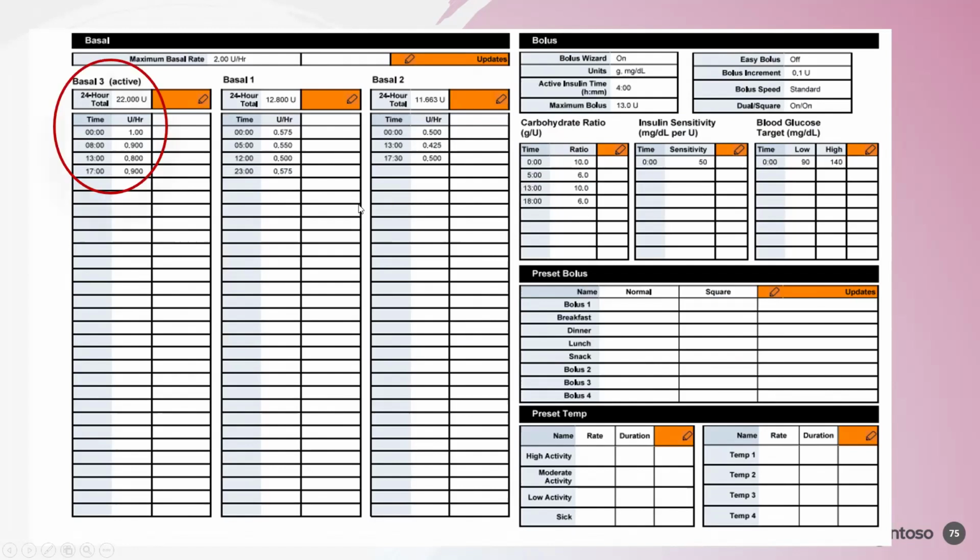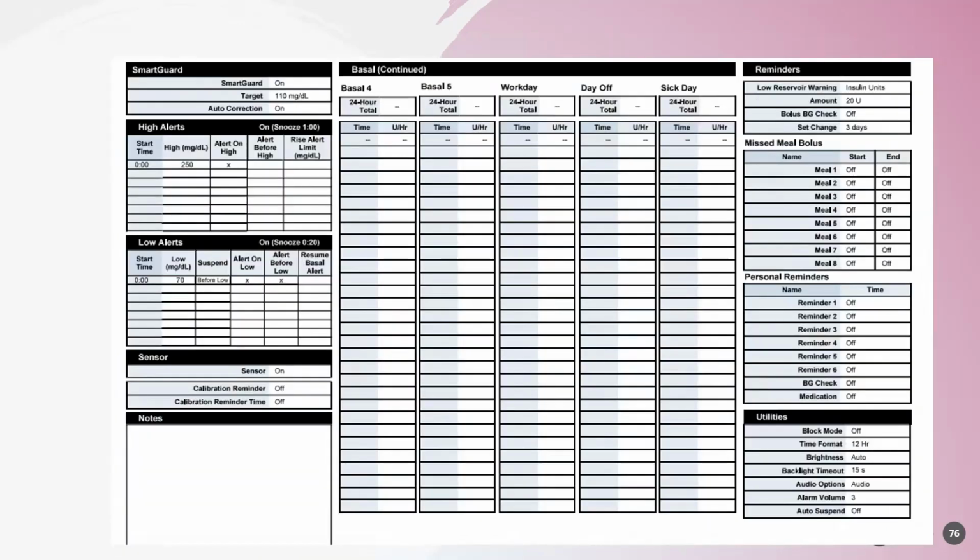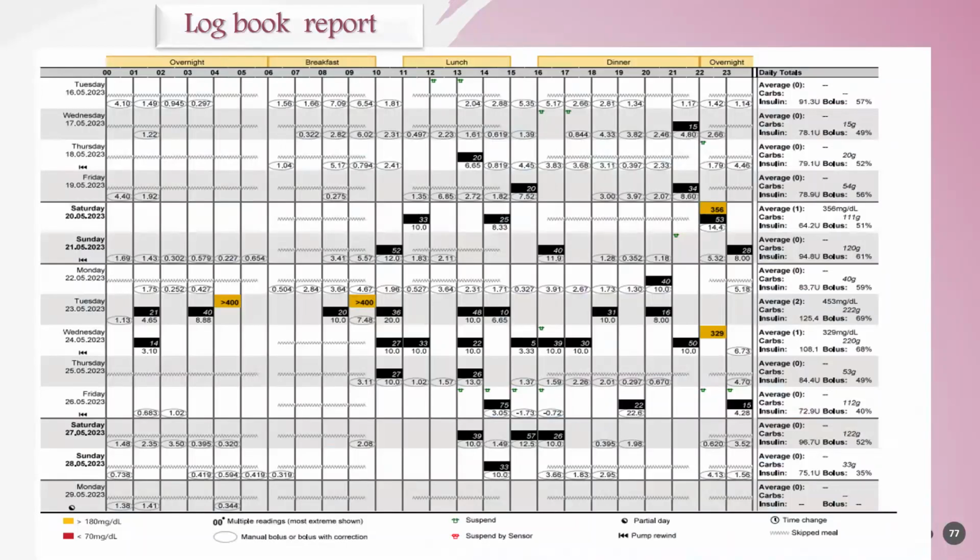So simply, sometimes in the clinic I make some sort of paper like this. I roughly scratch out the times. I write down the carbs, I write the basal rate, and I see later in the record and decide, oh, this time is not good, this time needs measurement like that. Because I cannot memorize the numbers, I make my scratch paper and then review. Okay. Then the logbook, we used to see it before when a patient was on a previous pump.